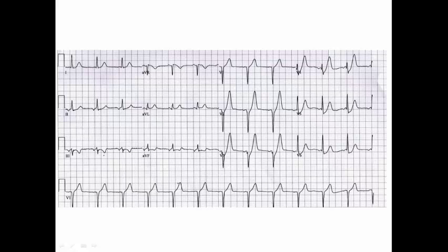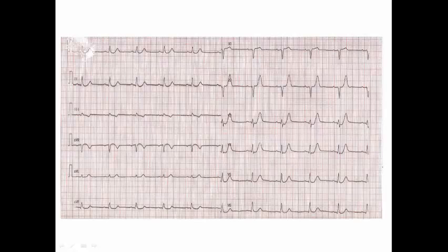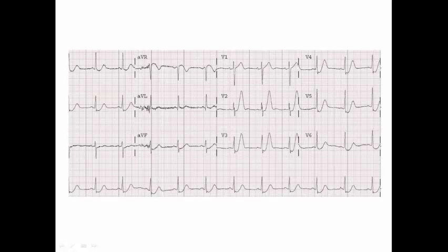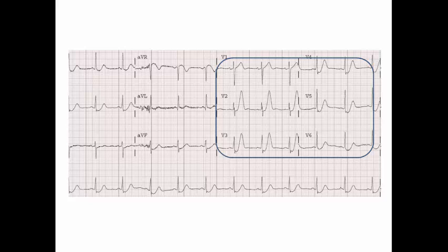We can see in this ECG that the patient has upsloping ST depression and hyperacute T-waves more than two-thirds of the QRS complex amplitude — this is De Winter syndrome. In the chest leads, there is upsloping ST depression and hyperacute T-waves from V3 to V5. In another ECG example, the pattern is present from V2 to V6, which is also consistent with De Winter syndrome.